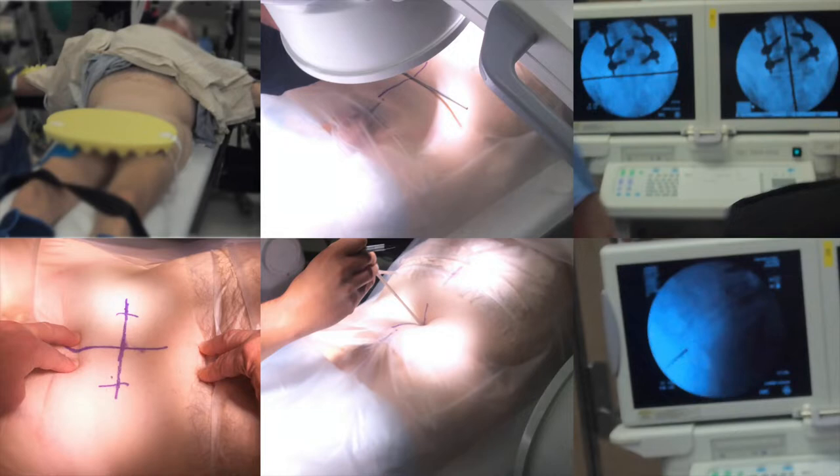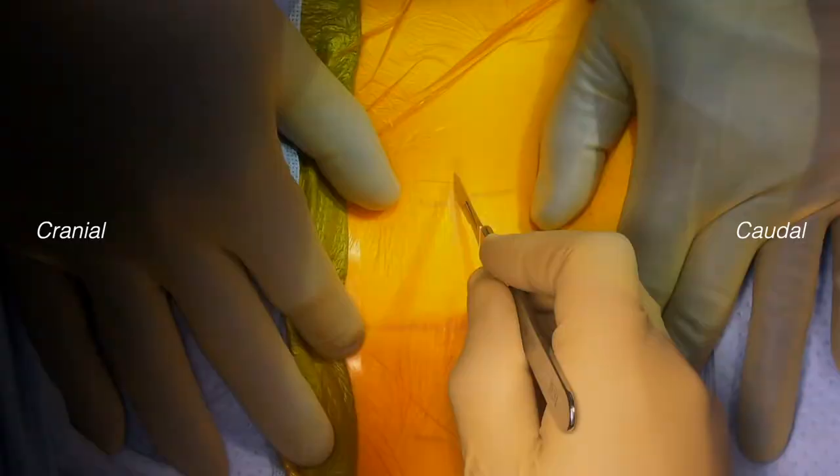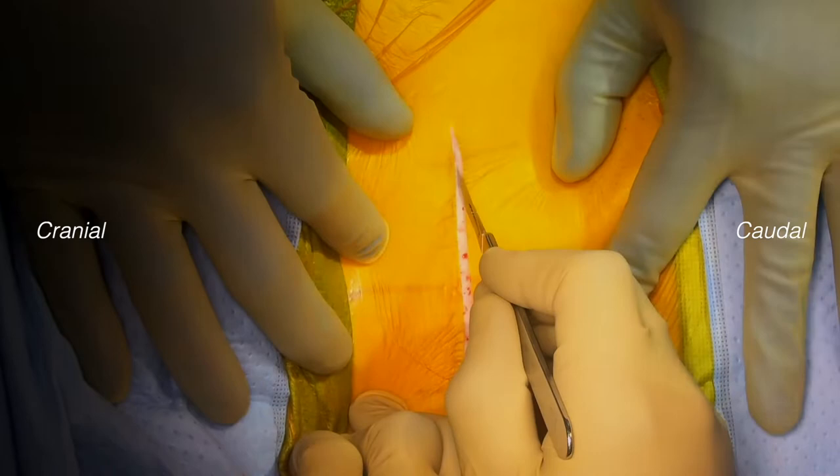Prior to the prep, we localize the disc that we will be replacing with a cage or disc arthroplasty on AP and lateral fluoro. We mark midline, and then a lateral line at a Pfannenstiel location that is in line with the disc to be operated on — in this case, L5-S1. A transverse midline Pfannenstiel skin incision is made in line with the approach and exposure to the L5-S1 disc.